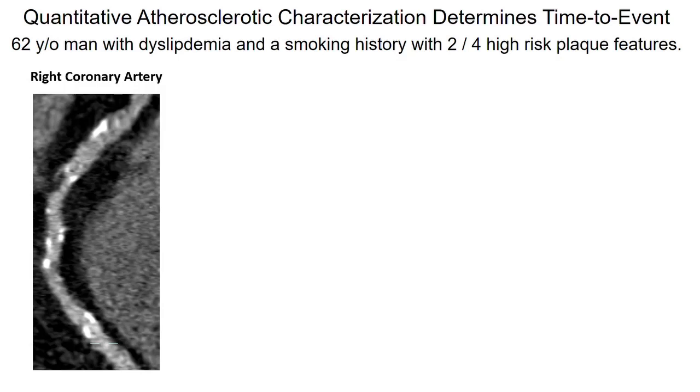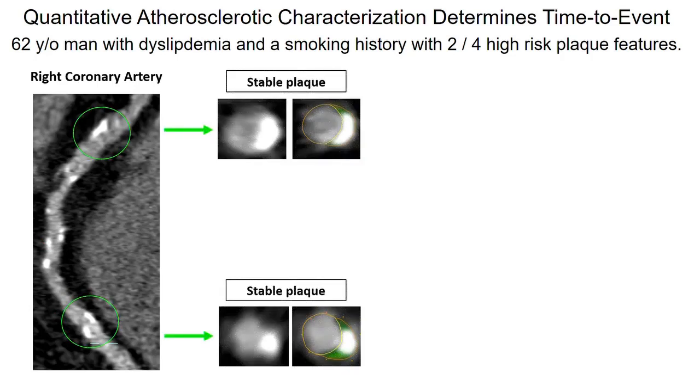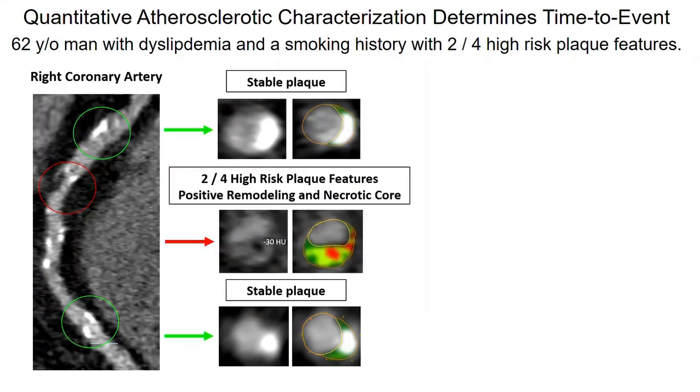And what I can show you is that this person has a tremendous amount of atheroma, right, all through this. And you see one here and here and here and all throughout the entire artery, it's speckled with atheroma. But in ICONIC, these kinds of plaques that you see there caused acute coronary syndromes and were the culprit lesions 0% of the time. So anytime you saw a purely calcified, highly dense plaque, it never caused acute coronary syndrome.